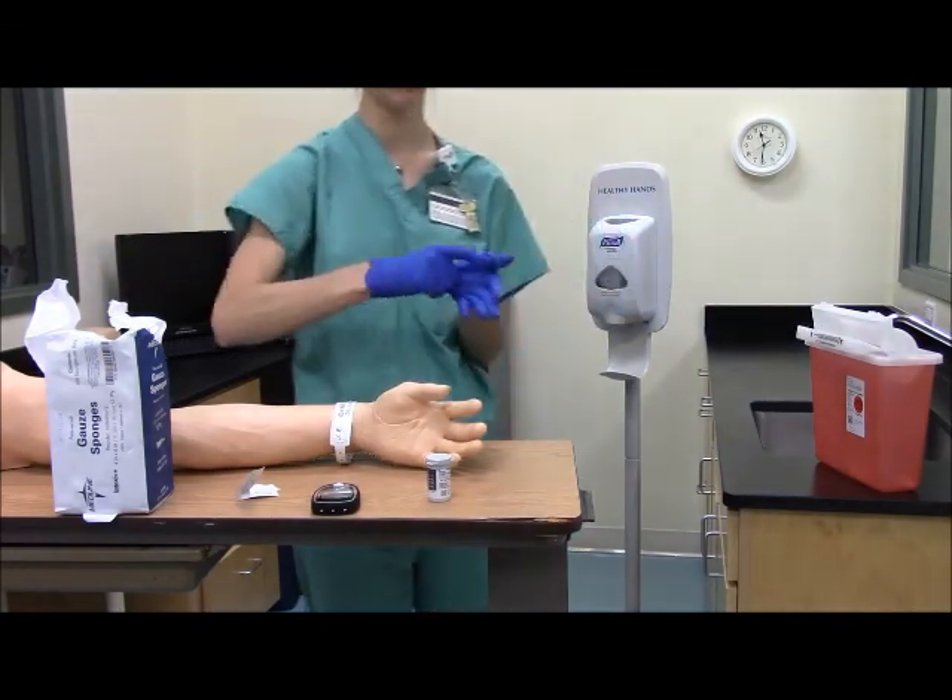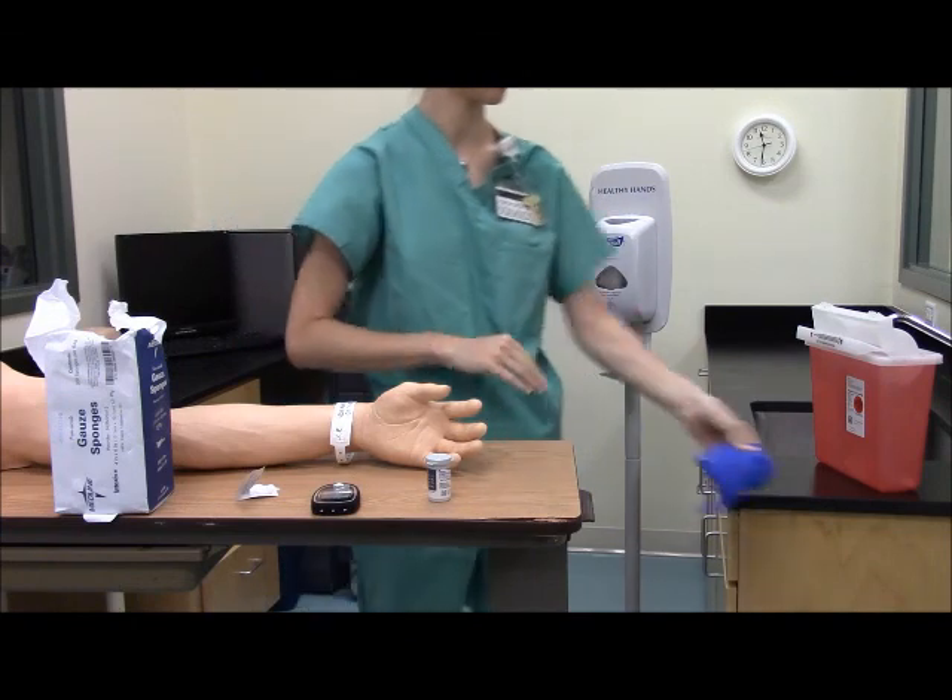Now remove your gloves and perform hand hygiene.